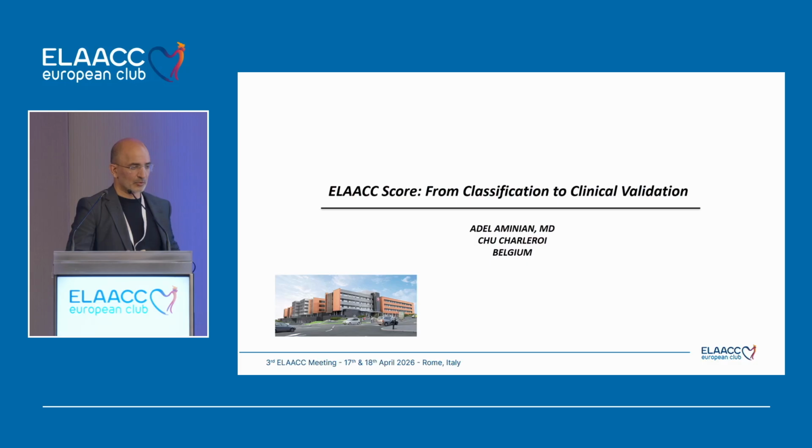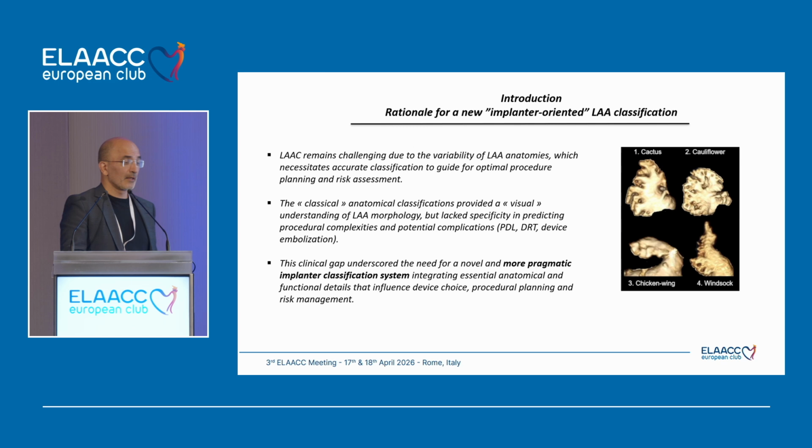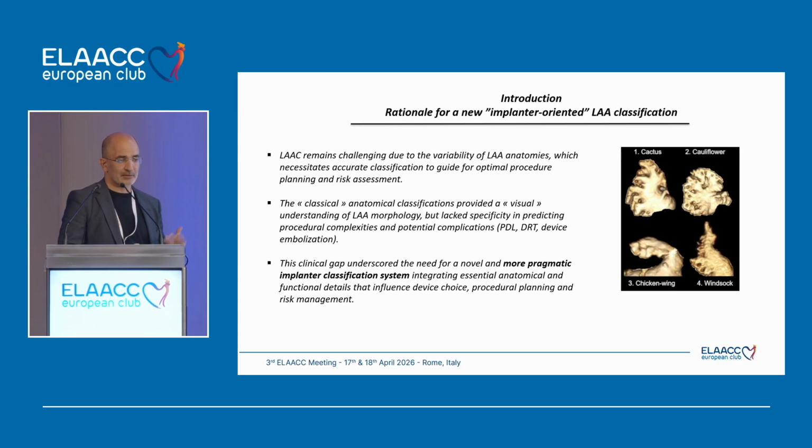So I think it's going to be a nice session because we will talk about the score, but also how to go towards a clinical validation of this score. I think it's very important. So these are my disclosures. So just for the people that are not yet aware of this classification, you know that the LAAC remains a challenging procedure due to the extreme variability of the anatomies of the left atrial appendage. And that necessitates some kind of accurate classification to guide the implanter for an optimal procedure planning.